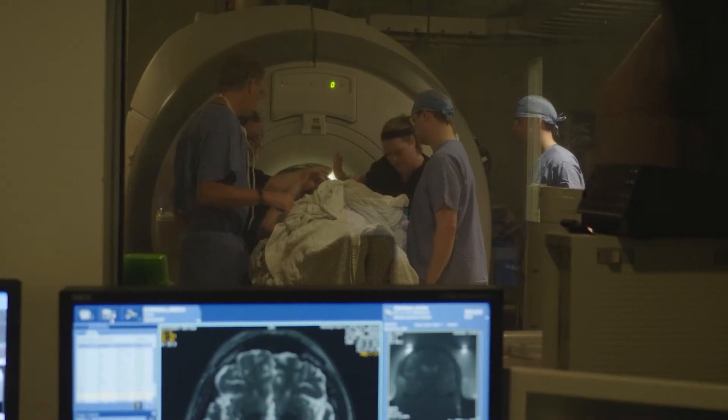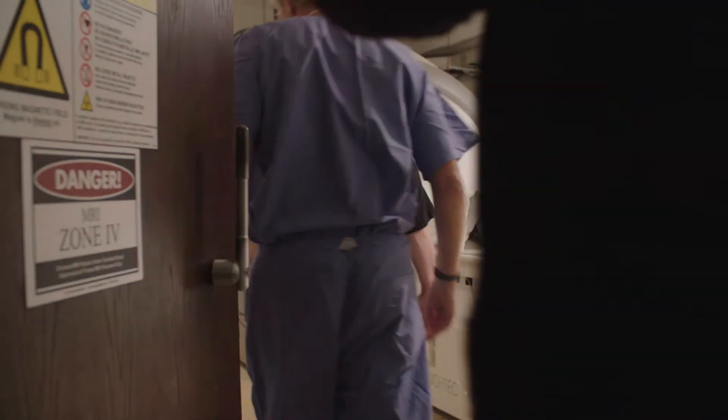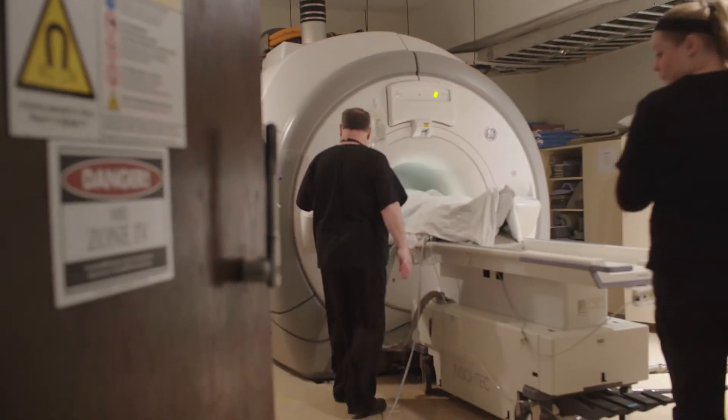Focused ultrasound is a new technique to treat movement disorders, primarily essential tremor. It involves focused beams of ultrasonic waves which coalesce on one part deep in the brain, so as to disrupt tremor cells and eliminate tremor. This is a non-invasive procedure which involves no scalpel whatsoever.